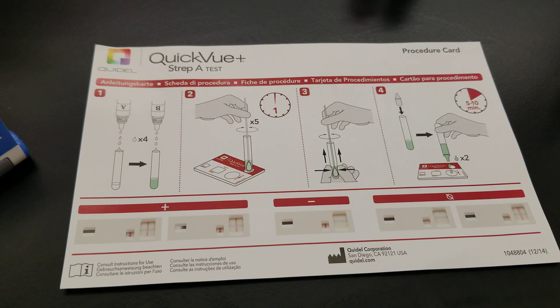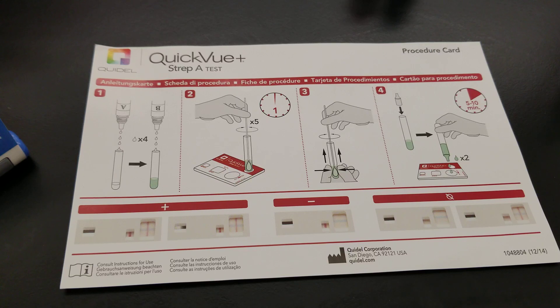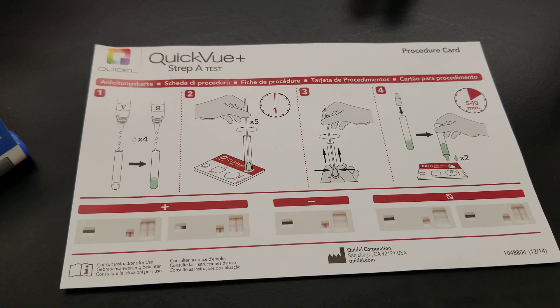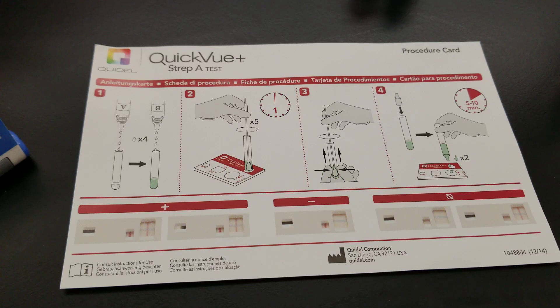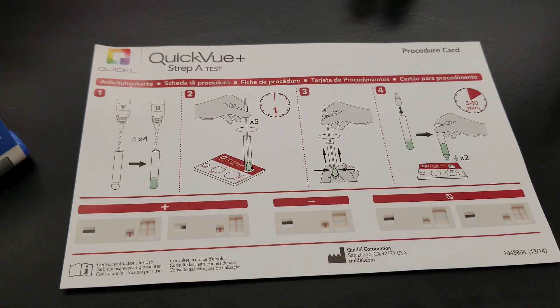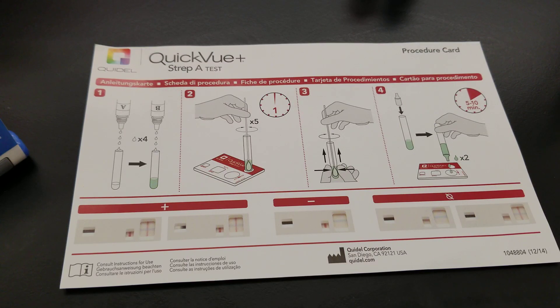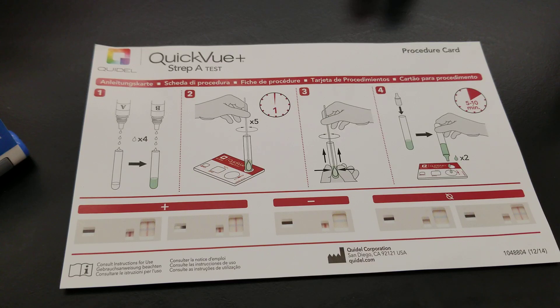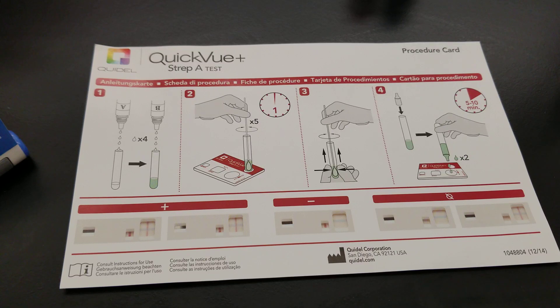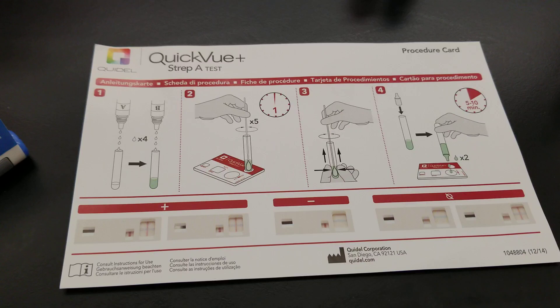Hello everyone. Today we are doing the WAVED rapid strep test and we're trying to identify if a patient has strep throat caused by Streptococcus pyogenes, which is group A strep. Another technical term would be pharyngitis caused by this organism. Pharyngitis is a sore throat, a throat infection, and what we're going to do is identify if that sore throat is coming from the causative agent of strep throat.